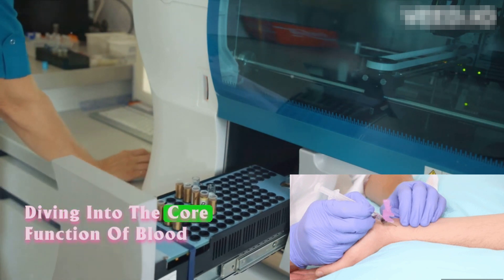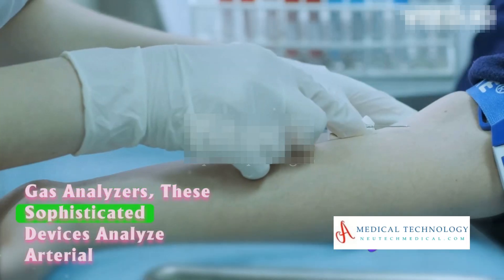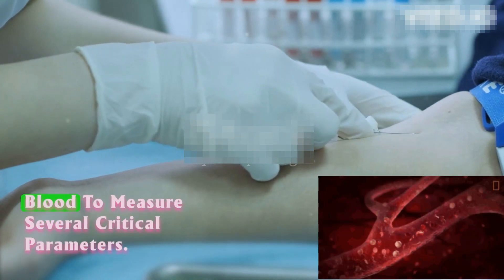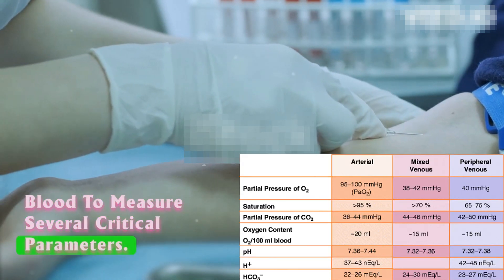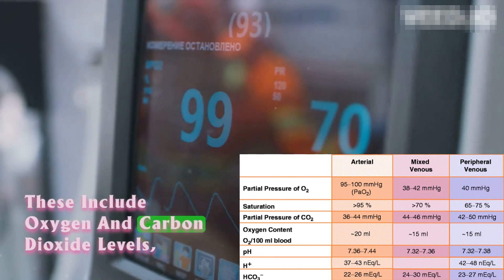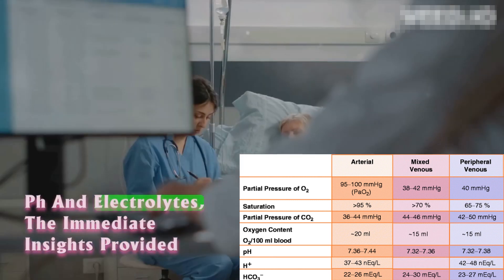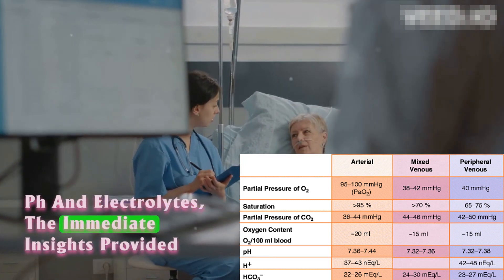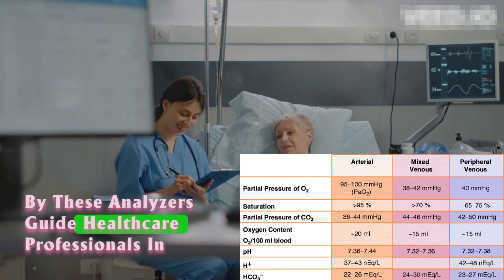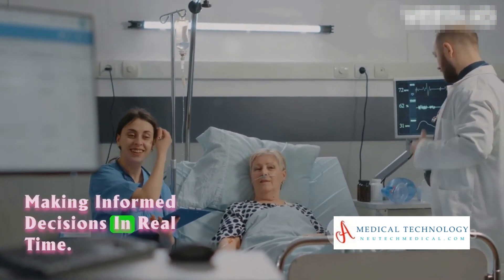Diving into the core function of blood gas analyzers, these sophisticated devices analyze arterial blood to measure several critical parameters. These include oxygen and carbon dioxide levels, pH and electrolytes. The immediate insights provided by these analyzers guide healthcare professionals in making informed decisions in real time.